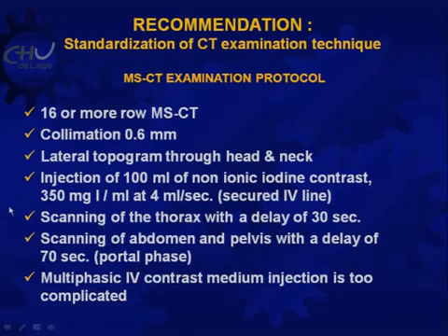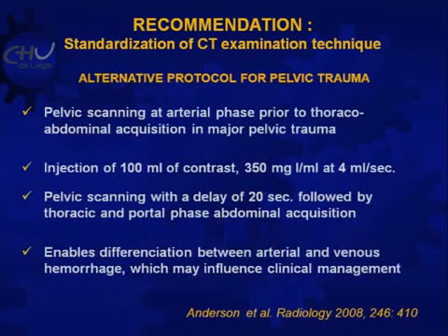I feel that multiphasic IV contrast medium injection is too complicated when you are in a hurry on an emergency basis. So a very simple protocol, only one phase injection, and then you wait 30 seconds to scan the thorax, and 70 seconds to scan the abdomen and the pelvis. Forget about whatever is written in the literature. Forget it. Fancy. Nothing to do with complicated trauma patients. That is just if you have time enough to count metastases in the liver, and even if you count 23 or 25, it doesn't make any difference. It's very nice, but it has nothing to do with management of trauma patients. Here we save the life.